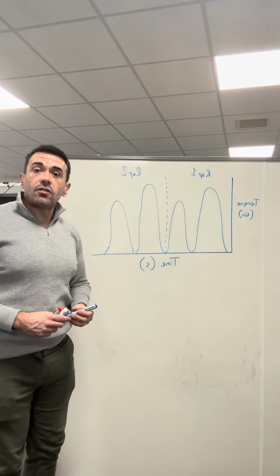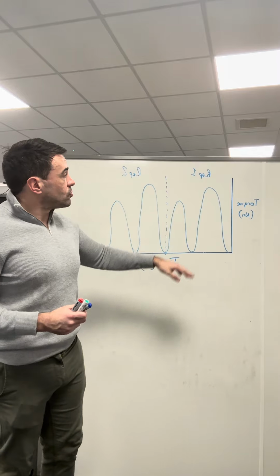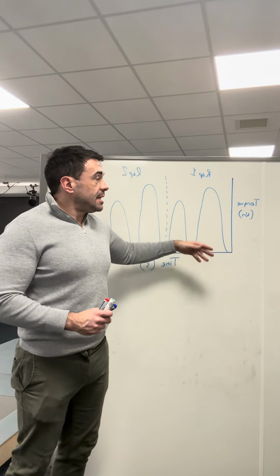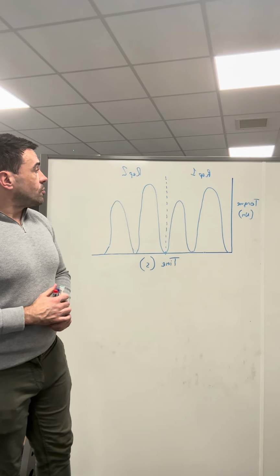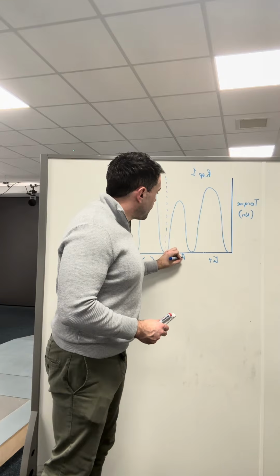You start the test with the knee at 90 degrees of flexion and extend. You begin with knee extension, so even if the first peak is smaller, you know that that represents the knee extensors. So in the repetitions we have here, this is extension, this is flexion.